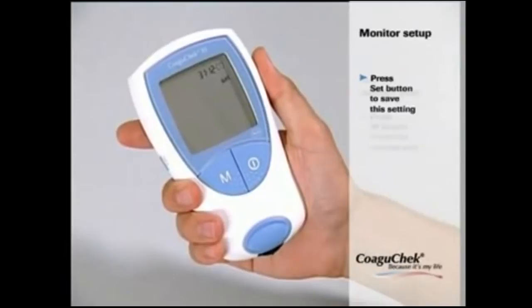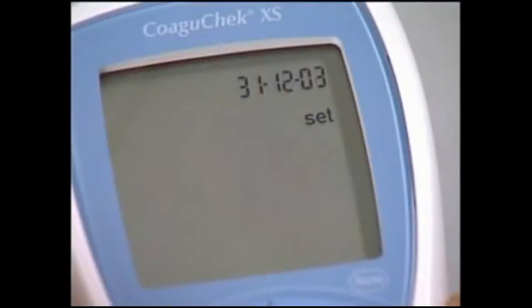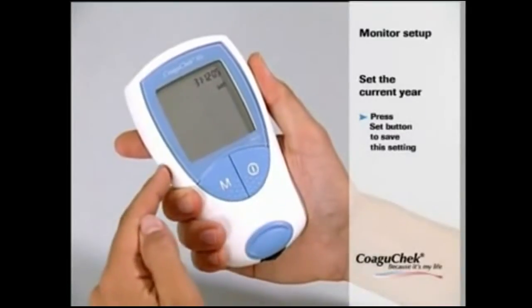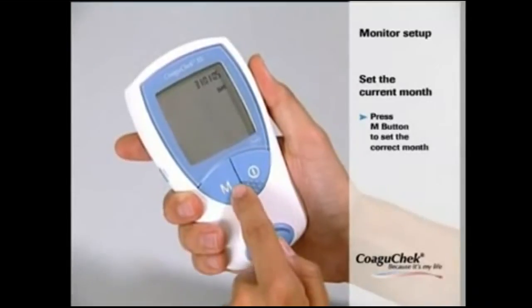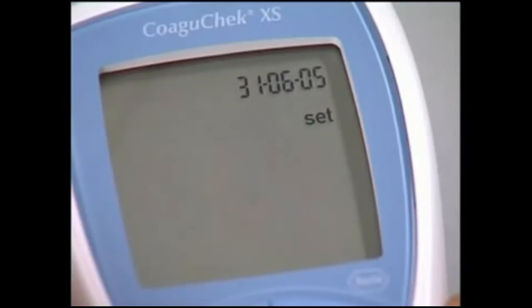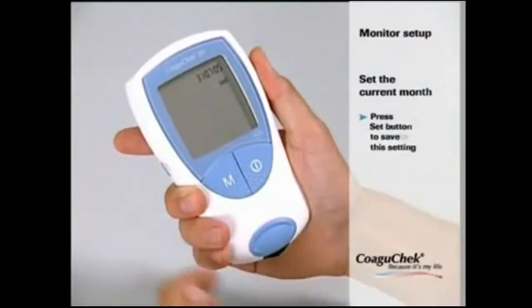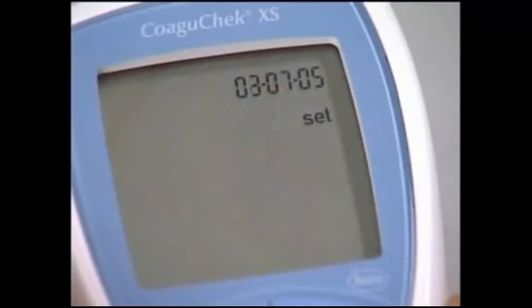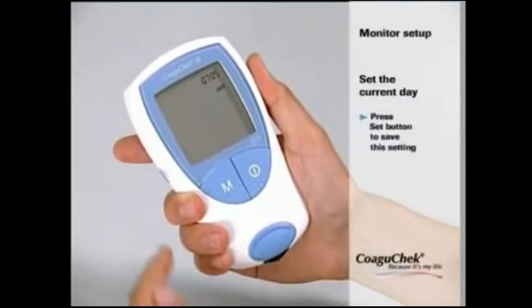The next step is to set the current year. Press the M button to change the flashing number until the correct year is displayed, and save your setting by pressing the SET button. Now press the M button until the correct month is displayed, and press SET to save. Finally, press the M button to set the correct day and save by pressing SET.